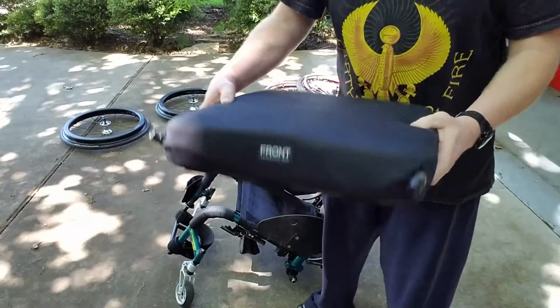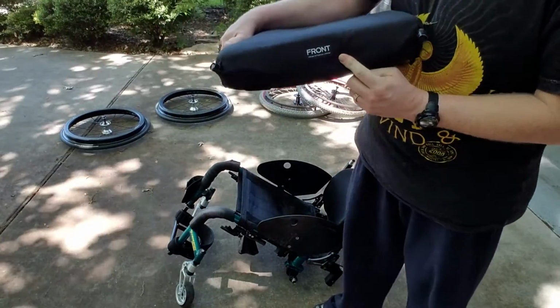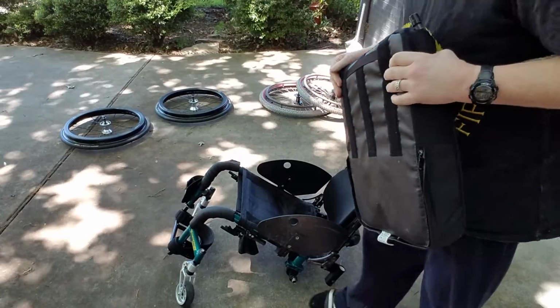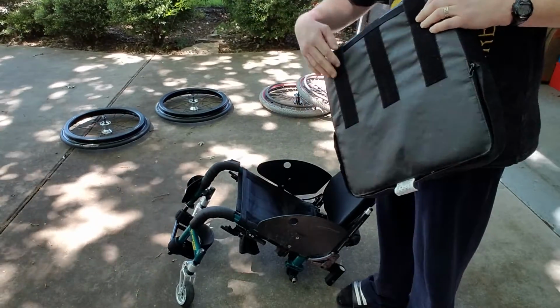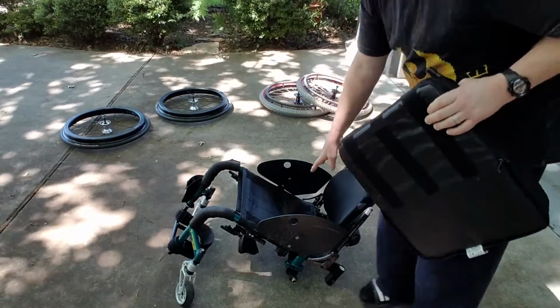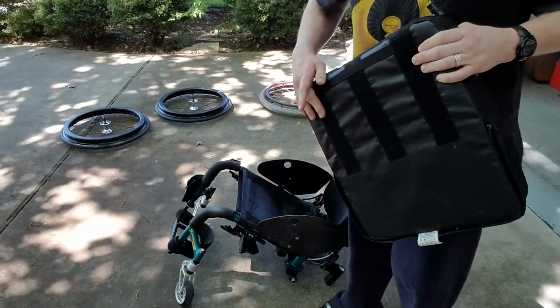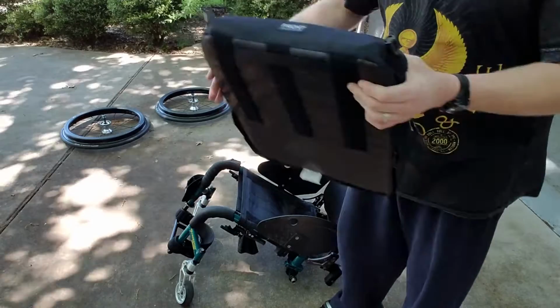Here's the cushion that comes on the chair. Little thing here to tell you which part faces front. It has these Velcro strips on the bottom, but the strips that are on the seat bottom itself are the same type of Velcro, so they don't attach. It just sits in there.